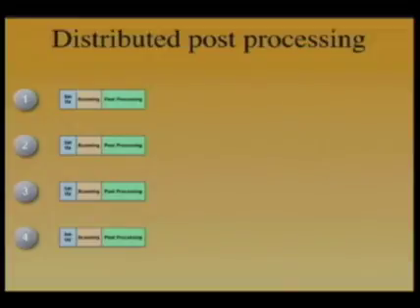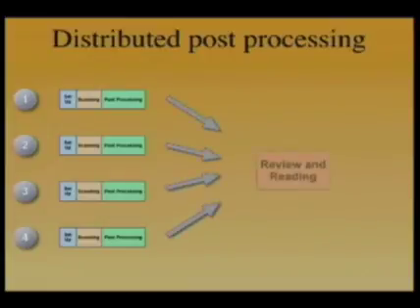The other alternative, because some of the ultrasound machines actually afford post-processing on the machine itself, is to do this in a distributed manner, so that in each room there would be setup and scanning, post-processing done presumably by the sonographer, and then the post-processed images would go to a central place for review and reading.